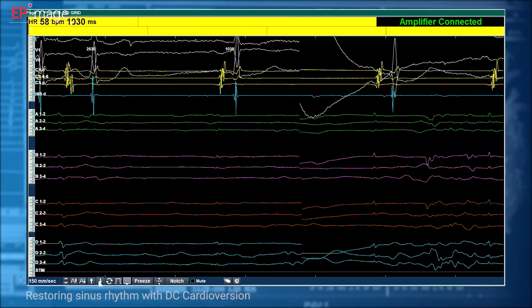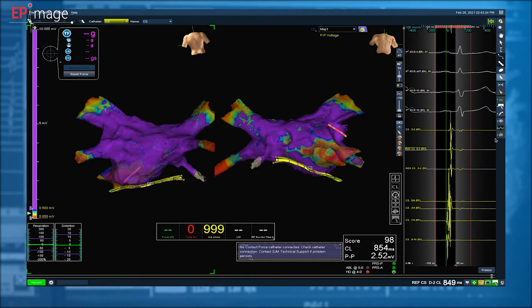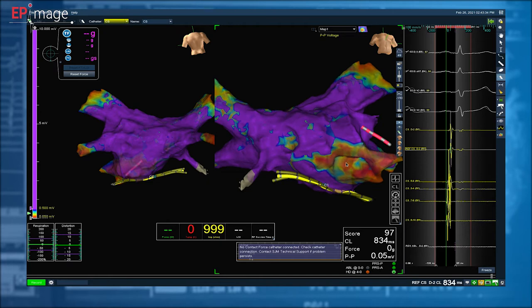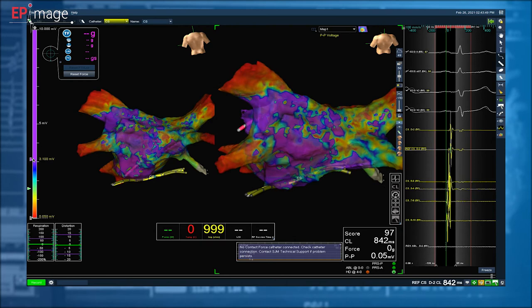So after the cannulation of the left atrium, we perform a cardioversion, and now during sinus rhythm, you see we introduce a HD grid catheter, and we started mapping the left atrium. It's a bit sped up because we don't want you to spend much time looking at our mapping. But what we see in this patient, the left atrium looks generally quite electrically healthy. So our main approach will be to focus on isolation of pulmonary veins.